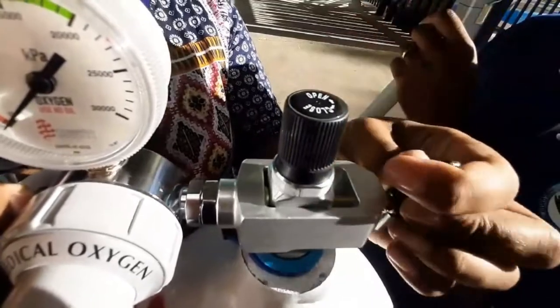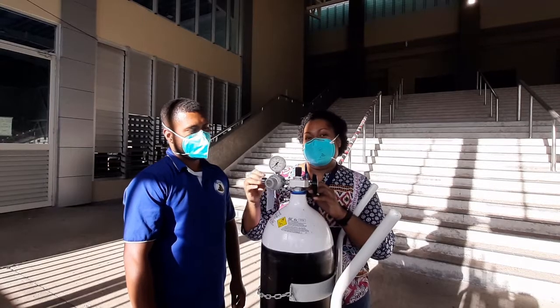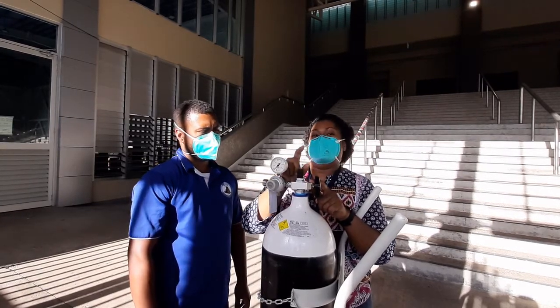This is important because we don't want oxygen leaking from the port. You can fit in your flow meter, but you need to make sure that the oxygen cylinder is closed.